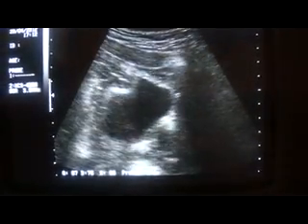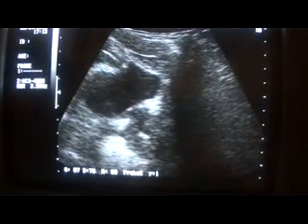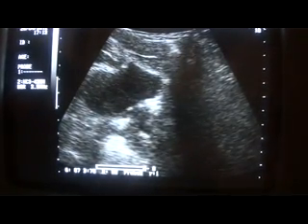This is the urinary bladder and you can see that the urinary bladder is normal — its walls are normal. This is the urinary bladder in transverse section.